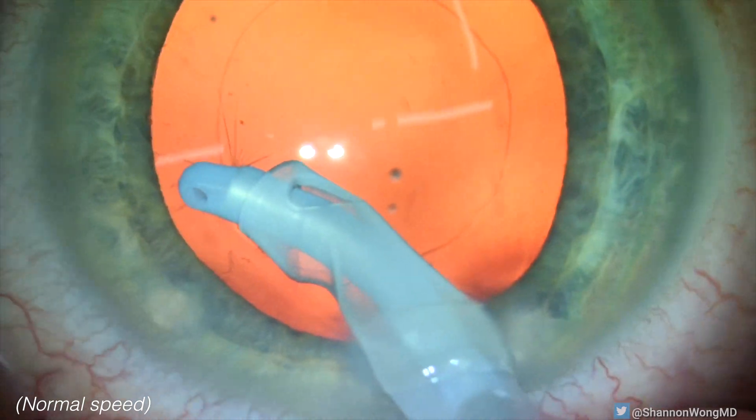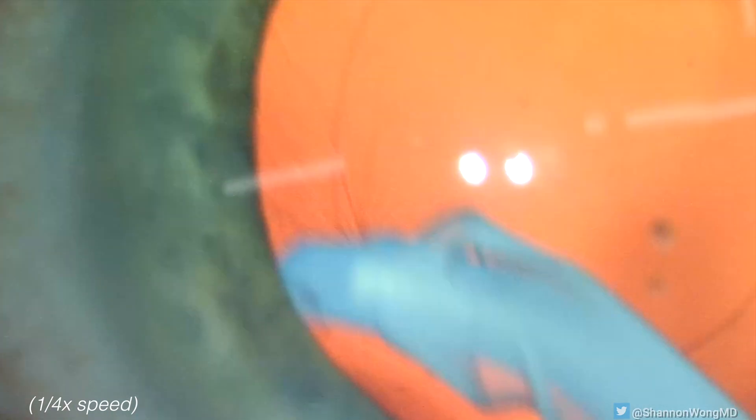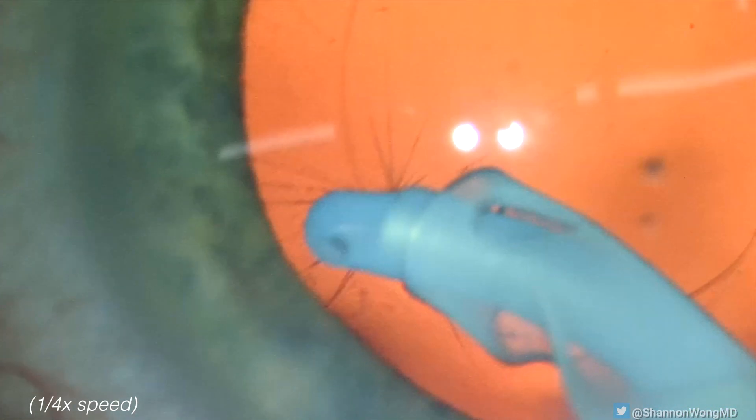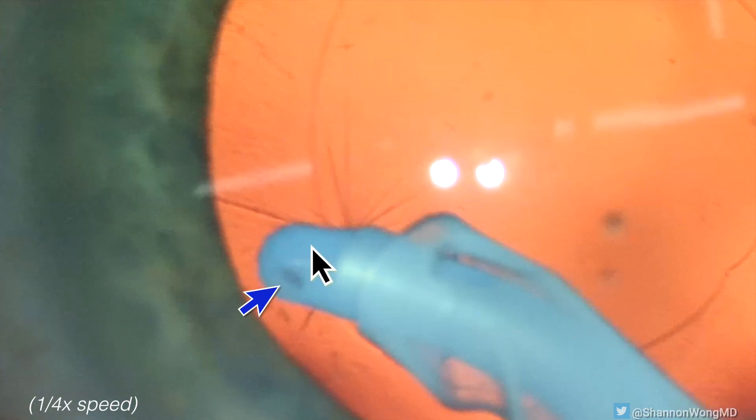Let's take a look at this again in slow motion. Though our aspiration port is facing upward, the posterior capsule is being aspirated. If we don't identify this sign, then the posterior capsule can easily be gripped and ripped.